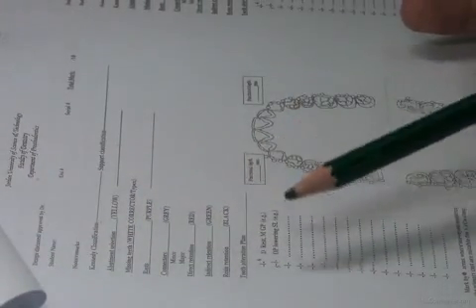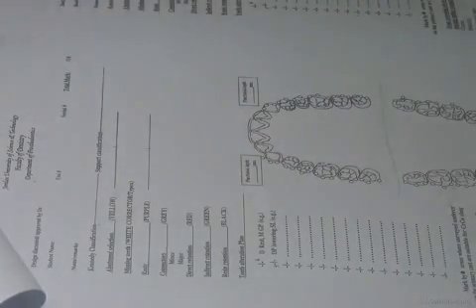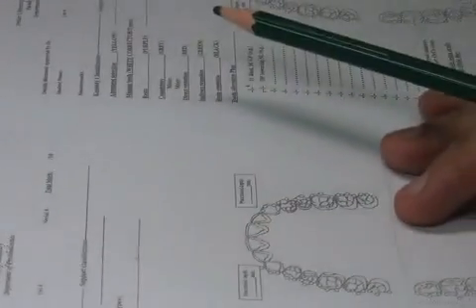If we go to the second page, we said it's an empty form. This is the form you fill in, and it has the following components. It has the information: your student name, your university number, your serial number, and some notes and remarks if you have any on this patient or on this cast.